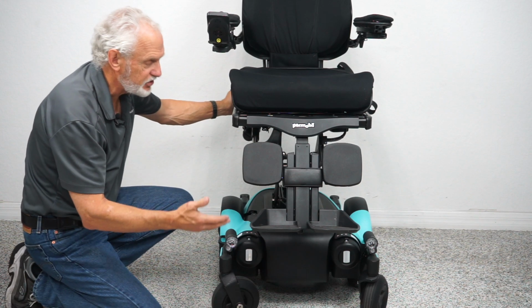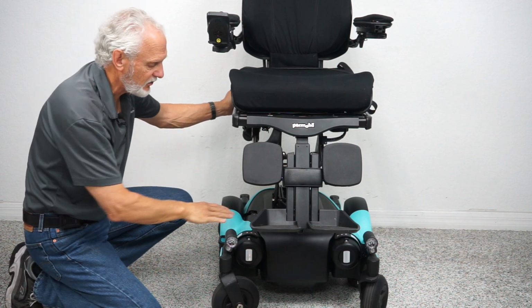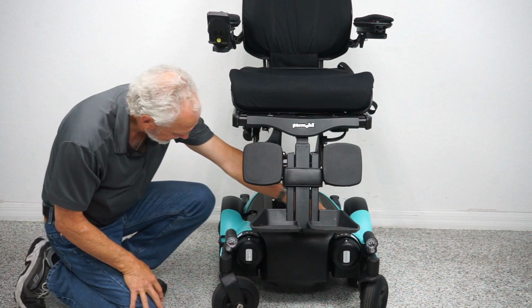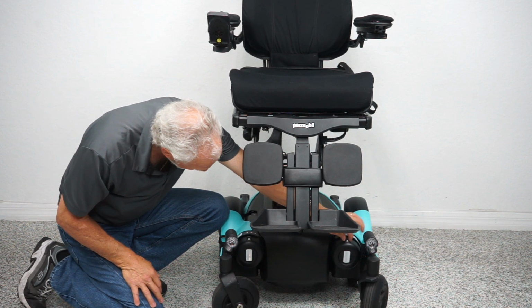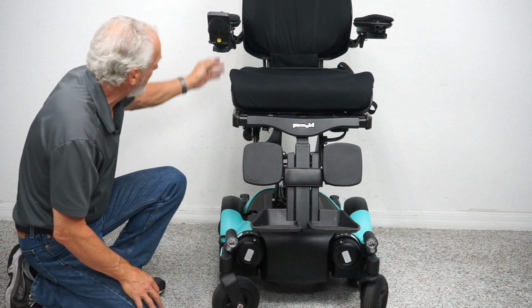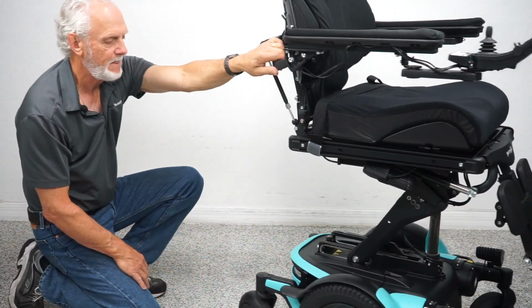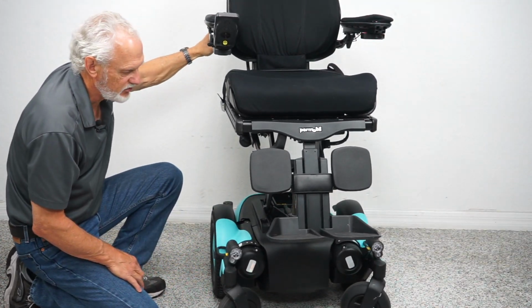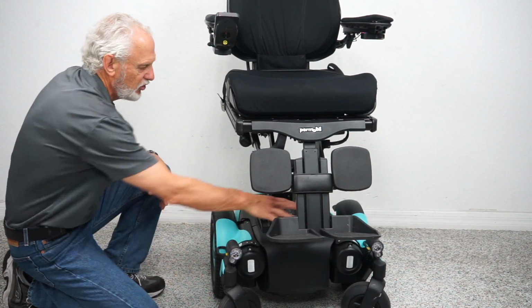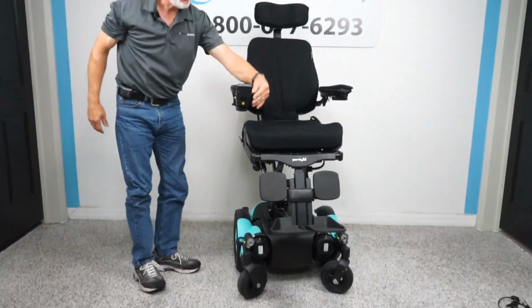But if I want to roll the chair, all you have to do is turn the power off. And the reason you want the power off, these are electric motors. You want no resistance. So power off, and you would go right here to the top of the motor. You see a little screw right there. You see there's a little handle. If you push it in, same thing on this side. Now your chair is in neutral, as you can see, okay? That's how you put the chair in neutral. When you're done, always put it back in gear. So those are your two motors for this chair right there. So let's turn the power back on.